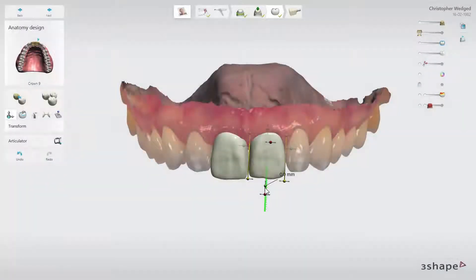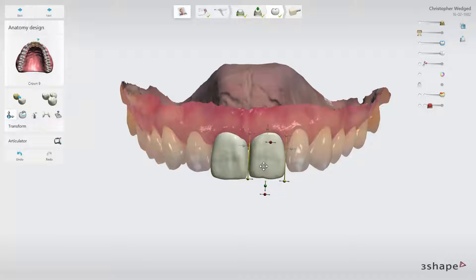You can also copy or mirror your design from another design. That option can be used, for example, when you work on two incisors. Once the design of one is ready, you can mirror it to another one.